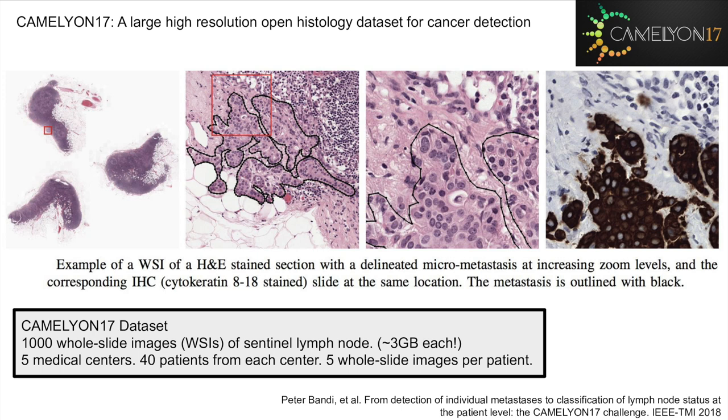Different types of stains will color the tissue in different ways. A major task in this area is segmenting cancerous tissue given an entire slide using standard H&E staining. Some stains can be very expensive, like the ones that bind to a specific receptor to detect specific cancers, so pathologists prefer to avoid using them over an entire slide.